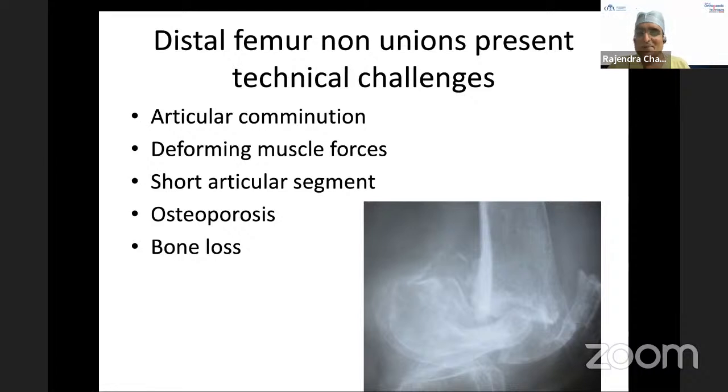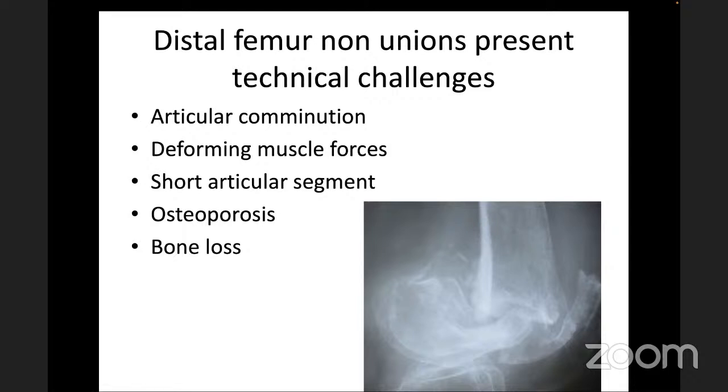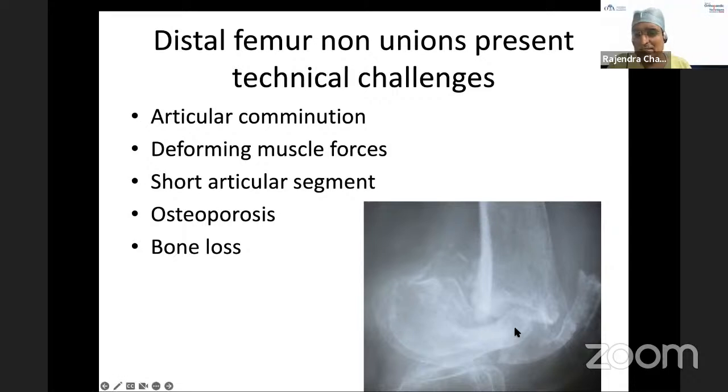So this was actually a patient who was around 70 years, female, with osteoporosis. And when we explored, the distal femur was just like a coconut shell with very little bone. So we were hardly able to pass any screw. And the place where some bone was there was posterior, which would have gone behind the posterior aspect of the plate. And this case is also around 15 years back, where an implant suitable for this situation was not there.